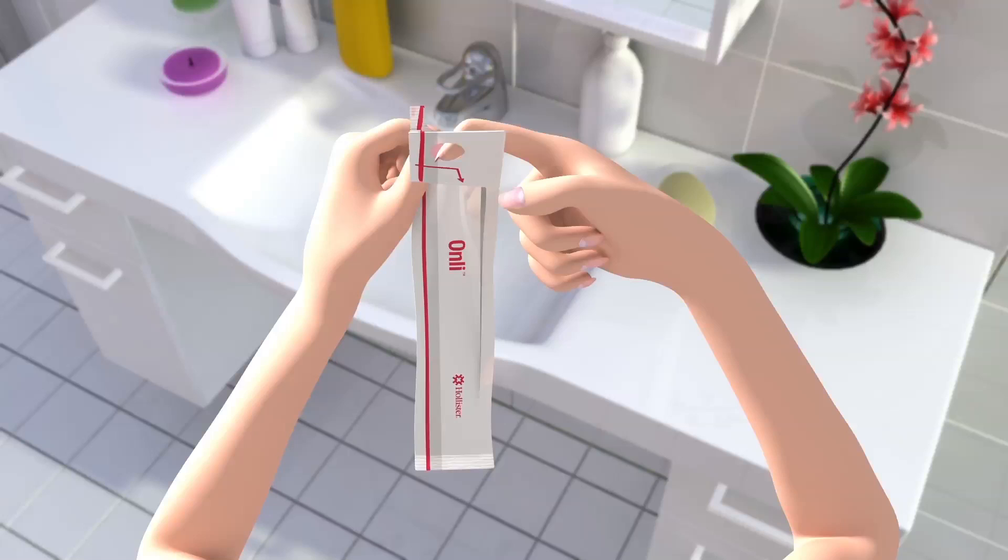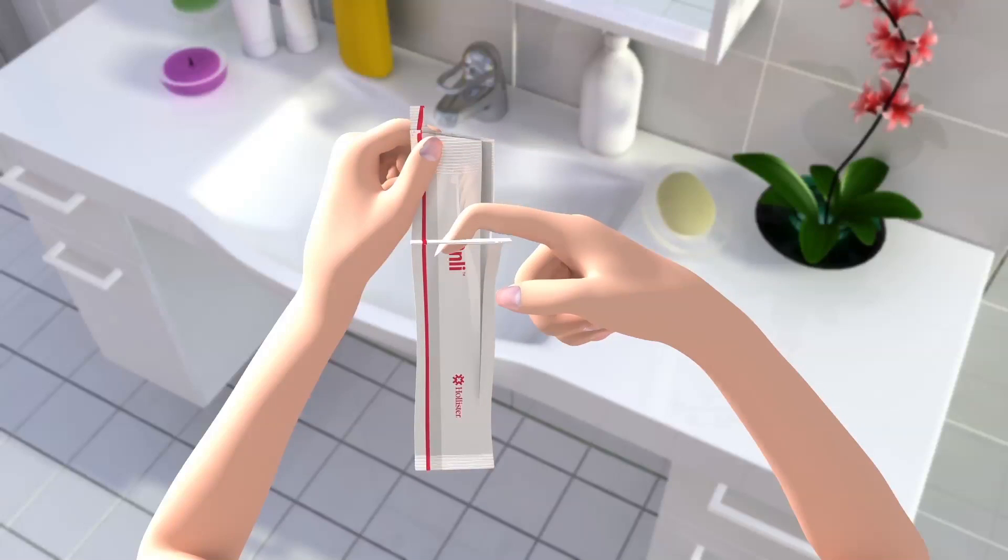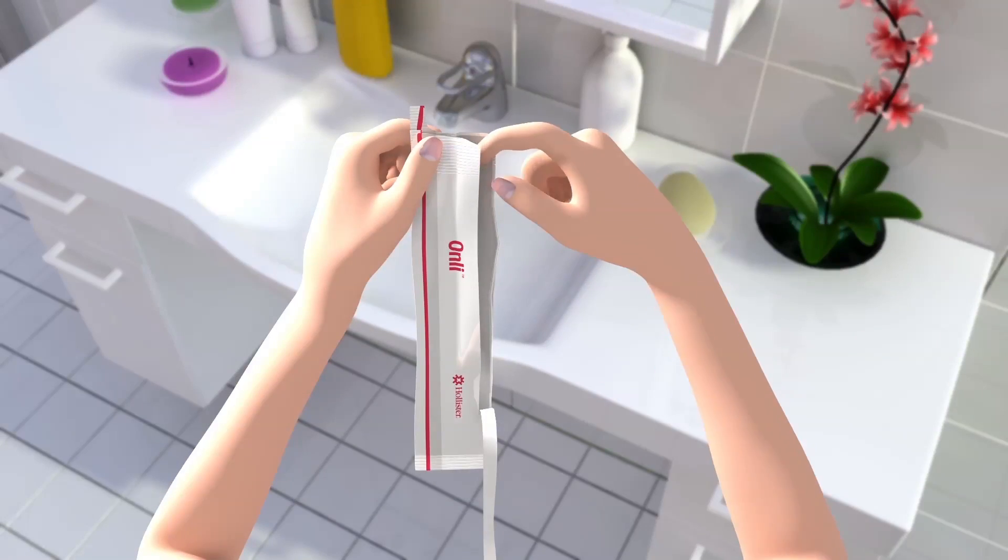To open the package, just pull the top finger hole toward you and at least halfway down. Remove the catheter by holding the funnel.